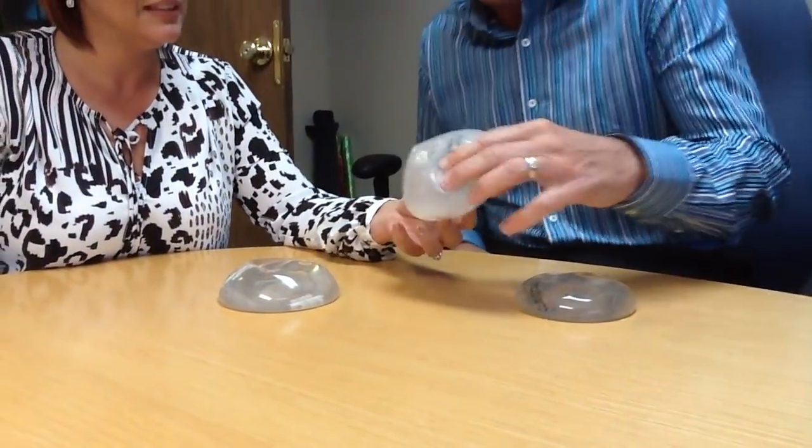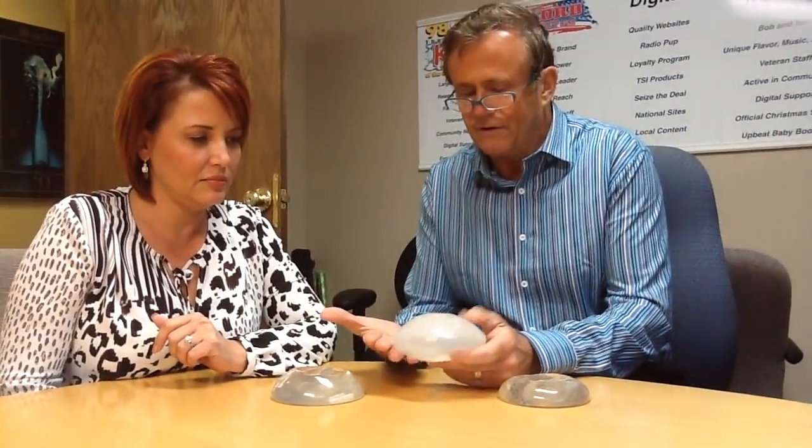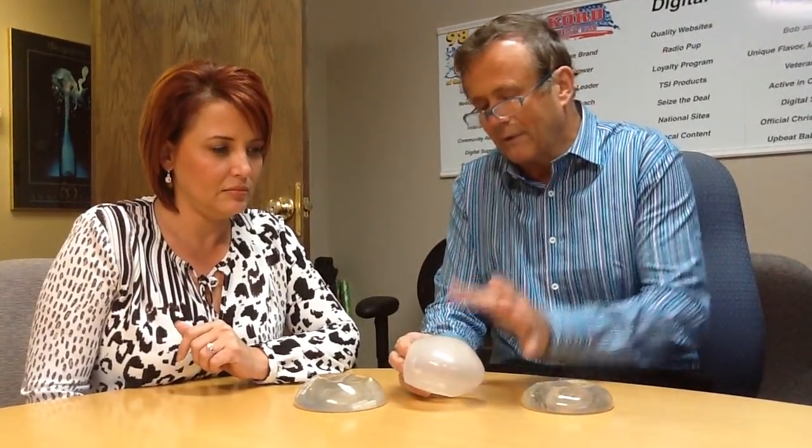This big blob is a saline-filled implant. Outside the body, air diffuses into it, but when it's in the body it's filled with normal saline. Saline, for everybody else, is salt water — same thing we put in IVs.